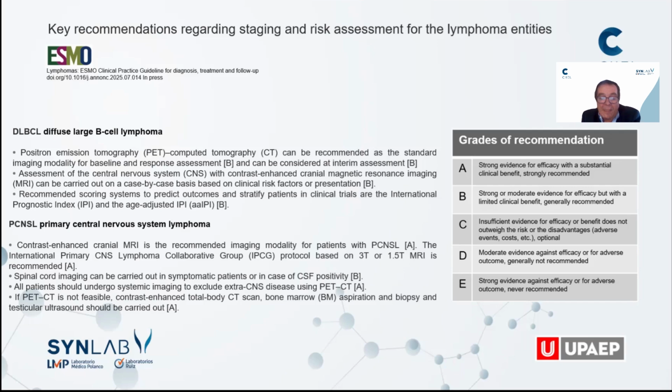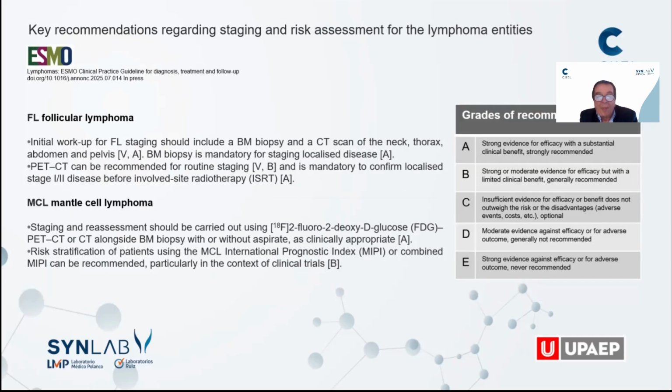In primary central nervous system lymphoma, PET-CT is mandatory to exclude extra central nervous system disease in other organs. In follicular lymphoma, PET-CT is mandatory in patients with limited disease before scheduled radiotherapy to confirm the localized disease. Moreover, it is recommended for routine staging.